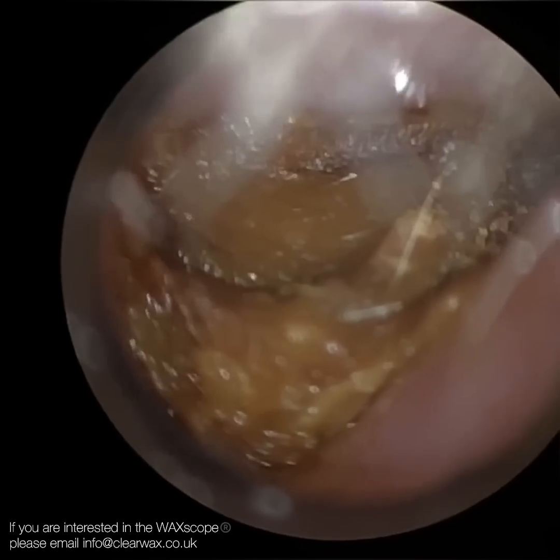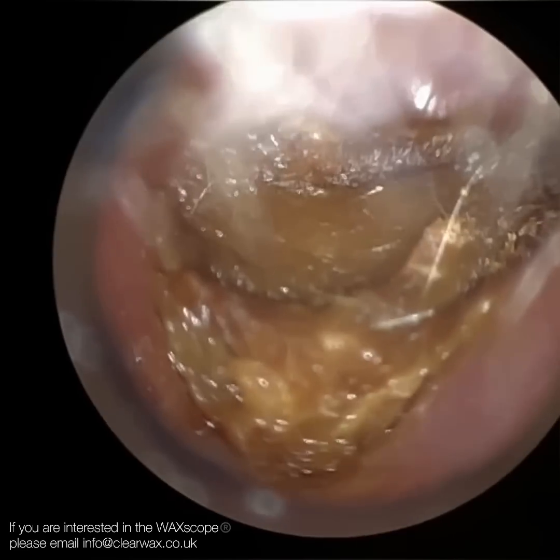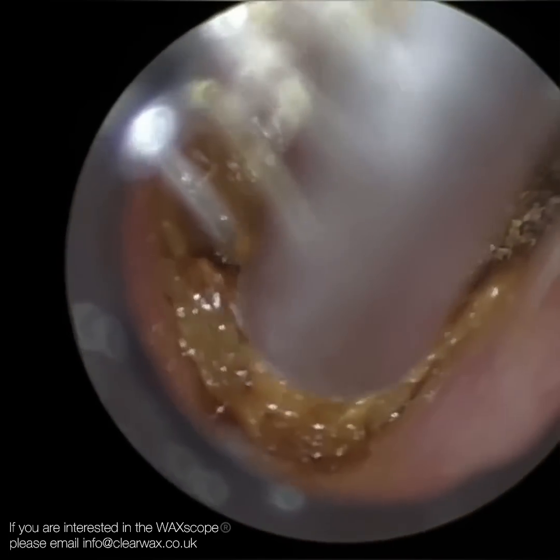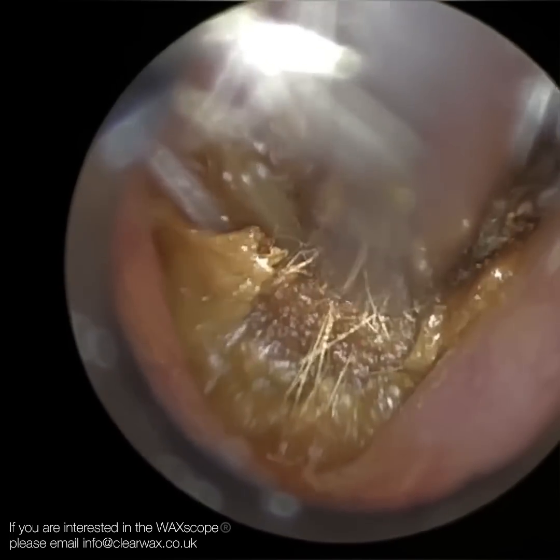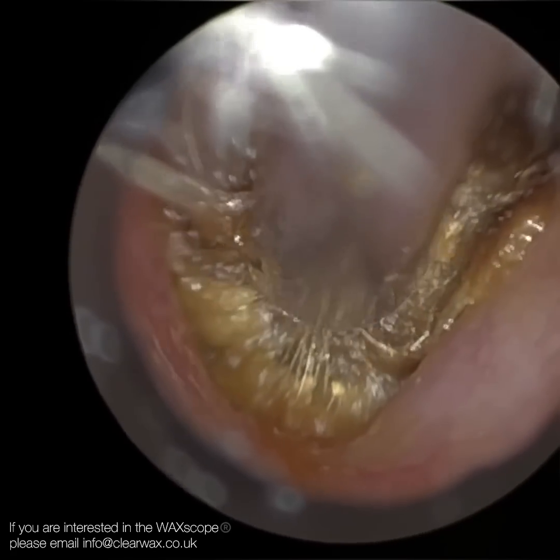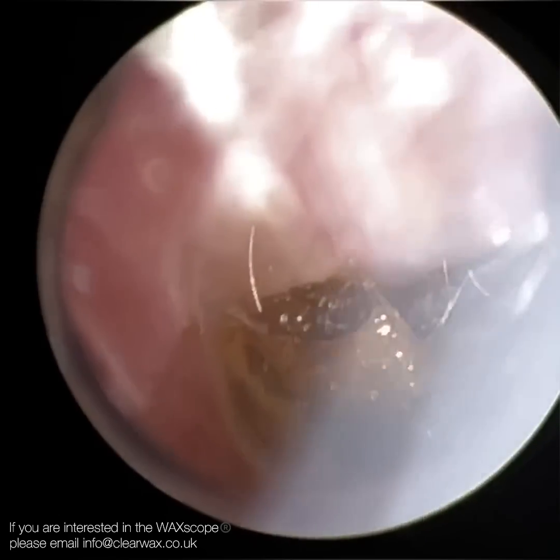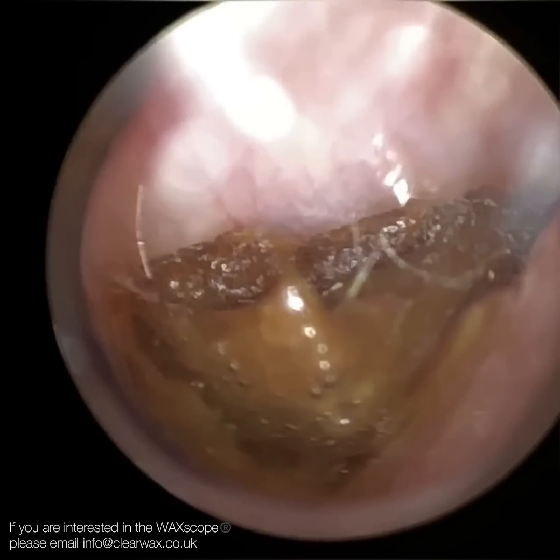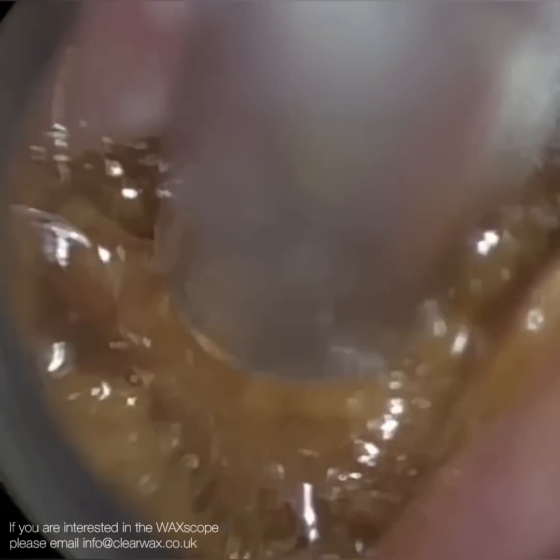The ENT surgeon had to chisel away a tremendous amount of bone to get access into the middle ear, because bone is not flexible. With the cartilage portion — the outer third — the speculum should only fit up to the junction between bone and cartilage, about one third into the ear canal. If it goes further, it makes contact with the bony part and can be uncomfortable for the patient. When a patient is awake, the speculum shouldn't protrude beyond the cartilage portion or make contact with the bony part.